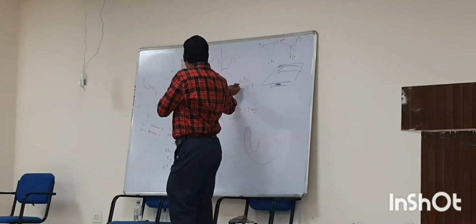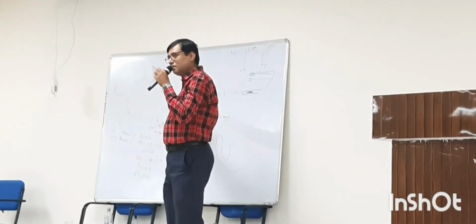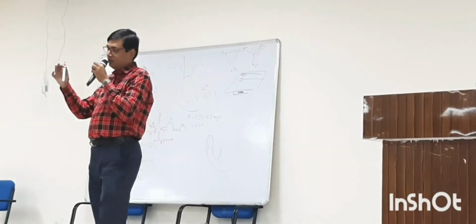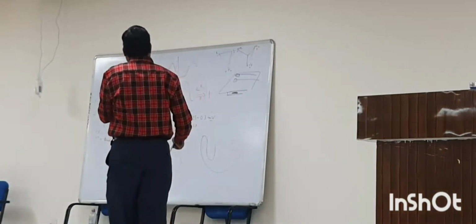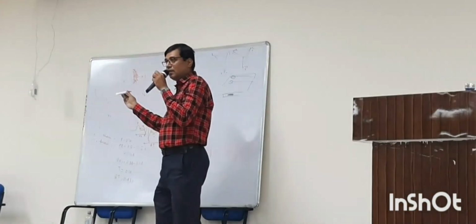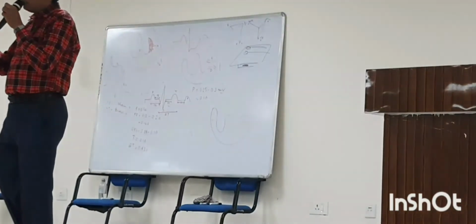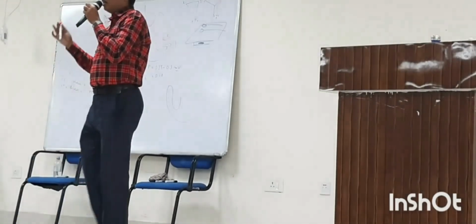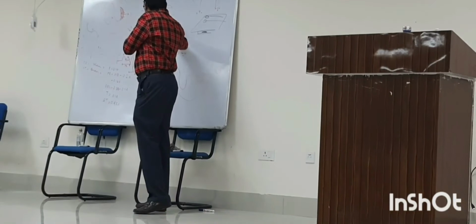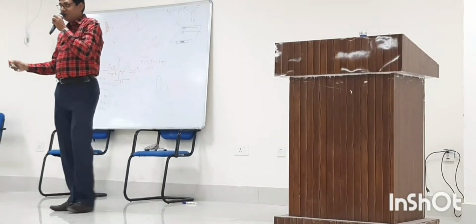This is the ventricular depolarization wave from subendocardium to subepicardium. Repolarization is just reverse, from subepicardium to subendocardium. So, if you consider the depolarization wave a positive wave, the repolarization wave is a negative wave. Repolarization goes from the opposite direction, subepicardium to subendocardium. A negative wave goes away from the electrode, so it gives a positive deflection, the T wave.